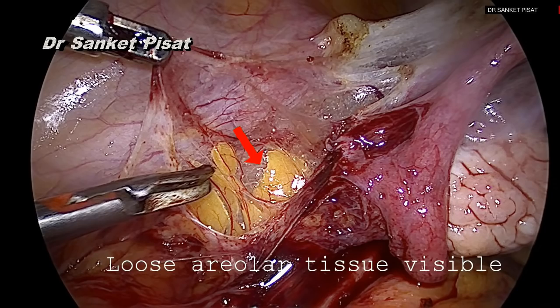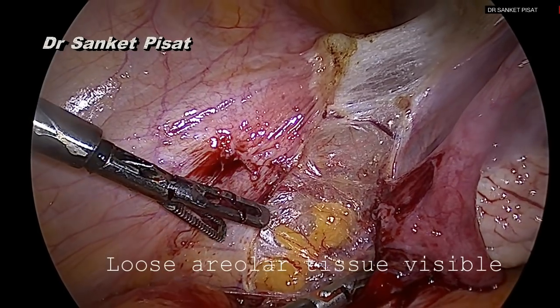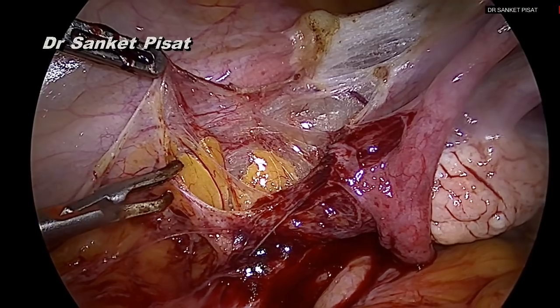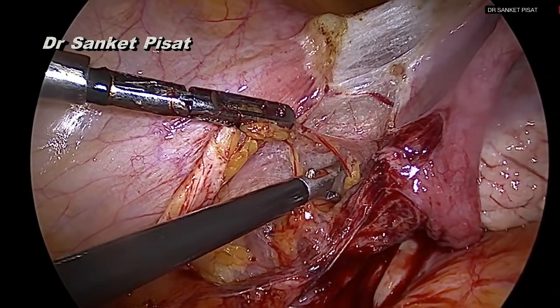Once this loose areolar tissue is seen, the next step is to hold it and to start cutting it so as to cut the transverse fibers that are seen between the anterior and posterior folds of the broad ligament.